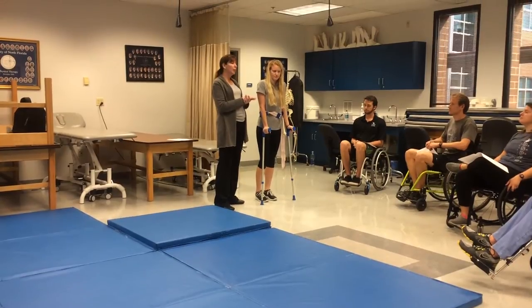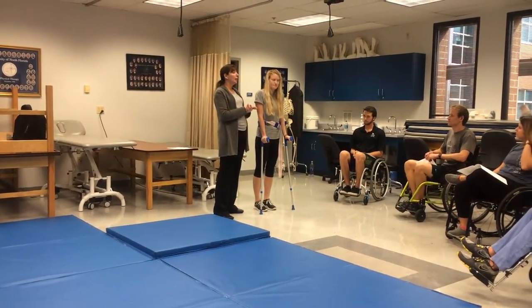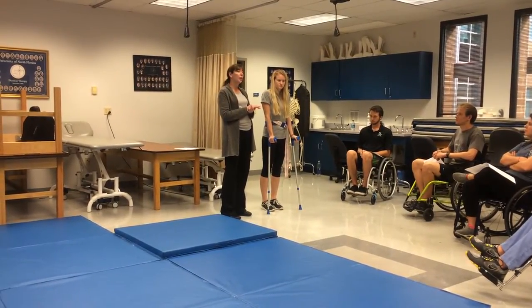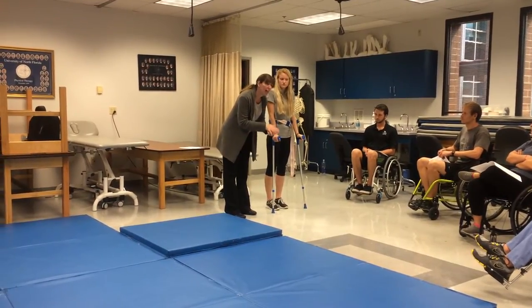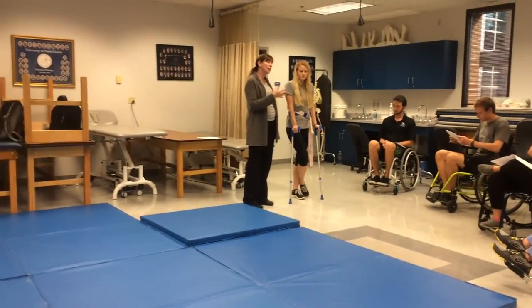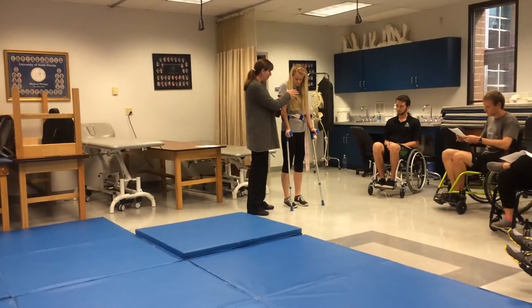Where would be a good place to guard your patient, and what are you concerned about? T10 — do they have hip extensors? No. So if their weight line comes forward, they're going to fold in half. They don't have hip extensors, so you're going to rely on your Y-ligaments. She has to have good hip range of motion.